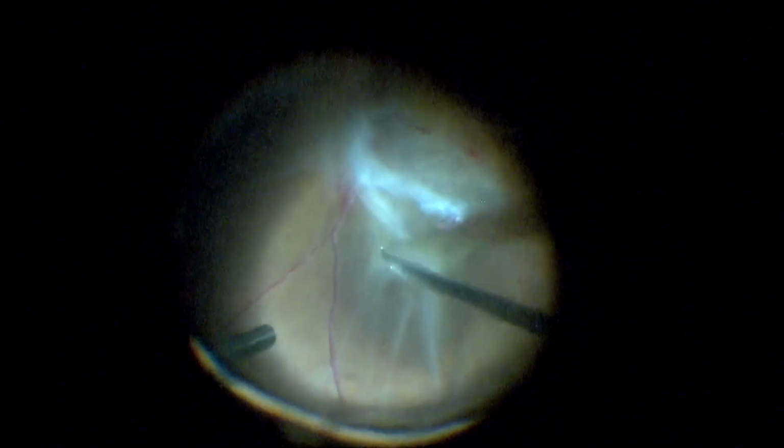This is another example of a large fibrovascular proliferation very close to the macula, causing traction on the macula. And once you have identified the secondary membrane, here the secondary membrane is seen to extend over the disc and beyond. And once we identify that, the membrane dissects a lot easily.